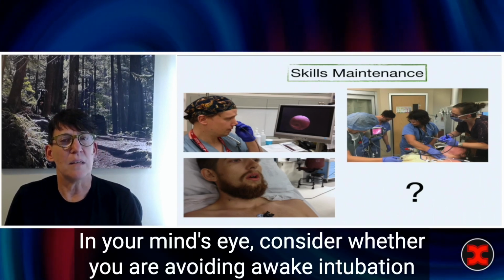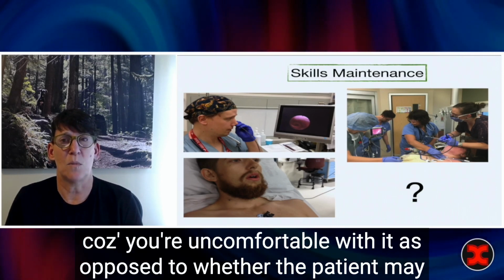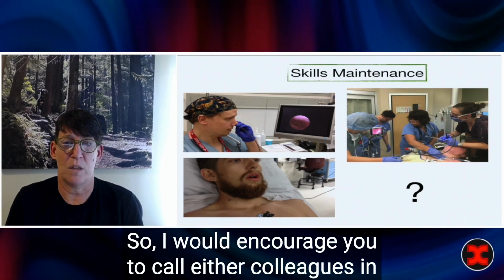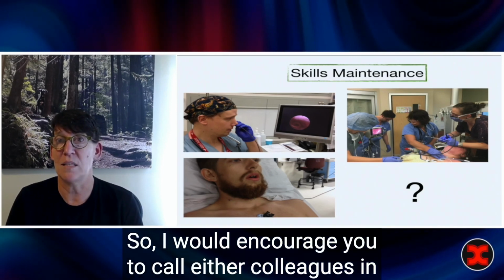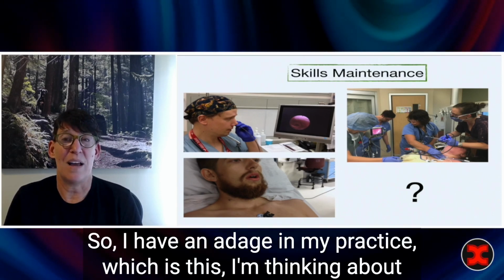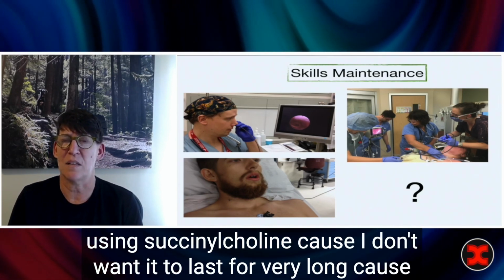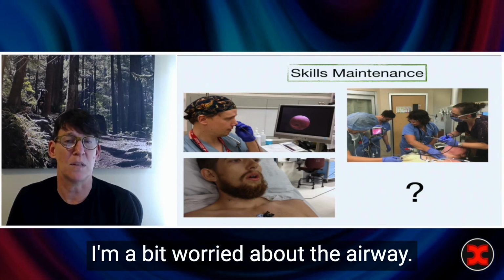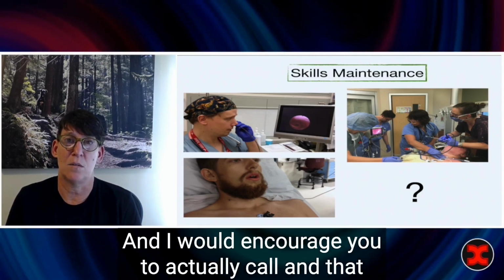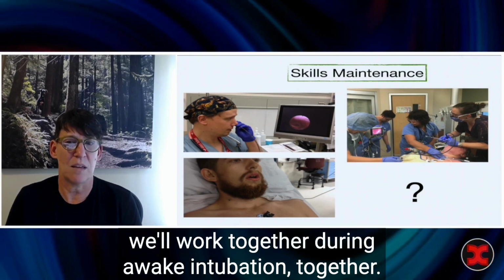In your mind's eye, consider whether you're avoiding awake intubation because you're uncomfortable with it, as opposed to whether the patient may require it and would benefit from it. So I would encourage you to call your colleagues in anesthesia, and I can tell you this, we avoid it too. So I have an adage in my practice, which is if I'm thinking about using succinylcholine because I don't want it to last for very long because I'm a bit worried about the airway, I will do that airway awake. And I would encourage you to actually call, and we'll work together doing awake intubation together.